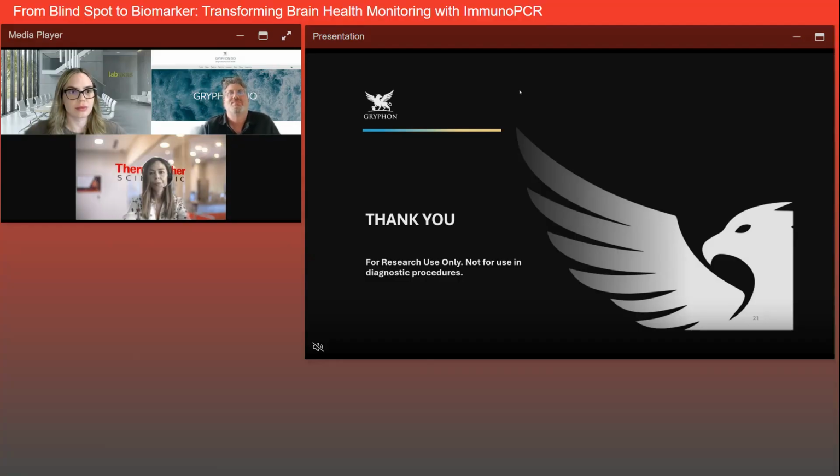And then for Alzheimer's, a similar answer: we want to measure the proteins at the earliest stage, well before someone gets Alzheimer's disease, 1 to 2 decades before AD onset, for example. And again, being at femtogram per mil levels works great. So I guess the short answer is I like to put everything in our favor to have the best odds. We tend to choose highly abundant markers and then pair them with the most sensitive detection strategies. But for most of our work, in that 1 to 10 picogram per mil range is usually sufficient.